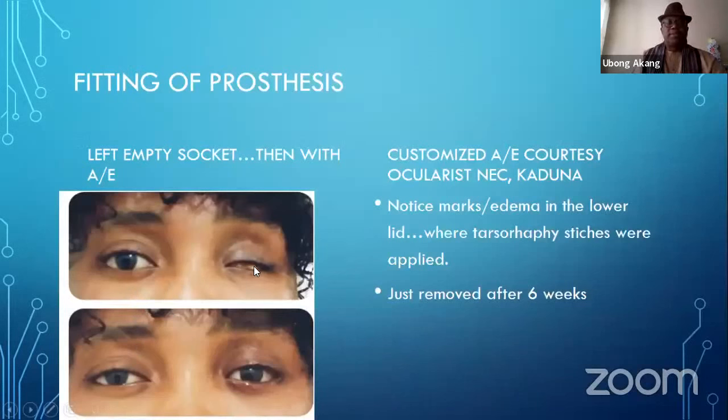This is how it is pre-op. First up, after you've removed your tarsorrhaphy and your conformer, this is what it looks like. Compare this. She squeezed this eye. Now look at this other eye. It's almost, apart from these dimples here from sutures, it's almost that's how it is after 6 weeks.